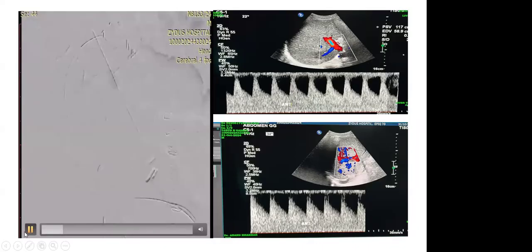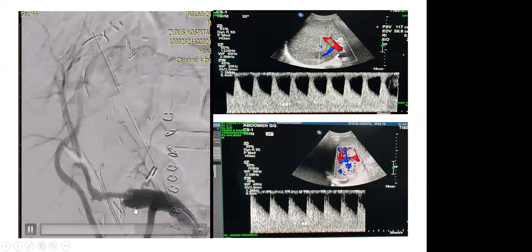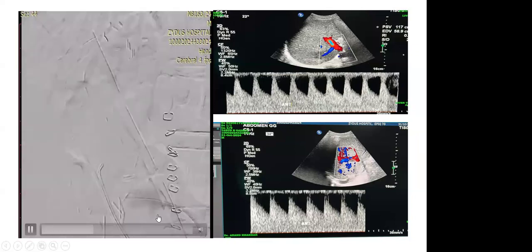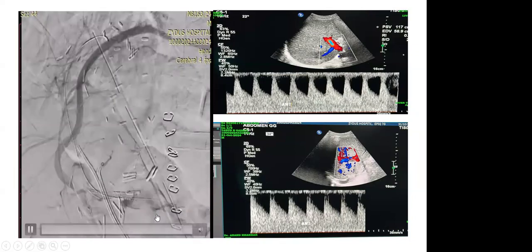Yeah. So this is the final result. Now here there is an issue. If anyone can identify. In this last image, there is one issue. So there is a proportionality of the parent vessel. The distal vessel is around 3 mm. We have put the stent of 2.75. So ideally it should be around 3 mm. But now we don't have that option.